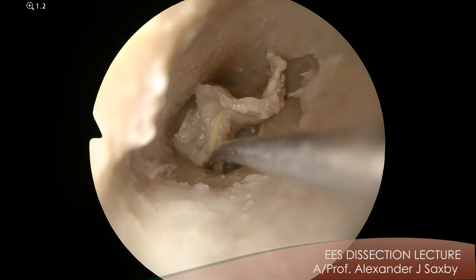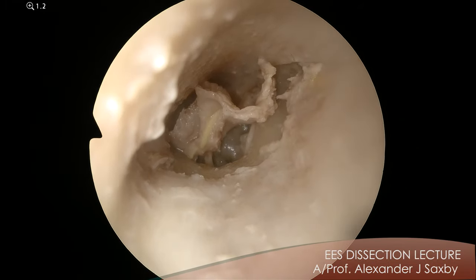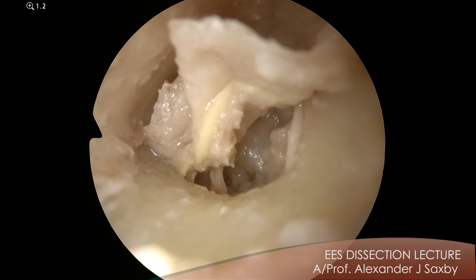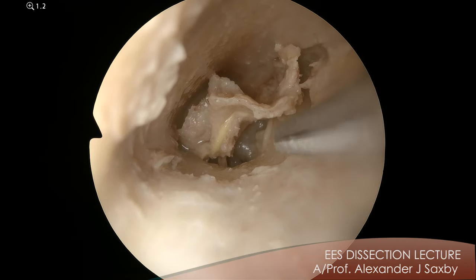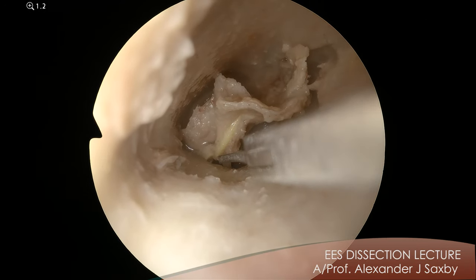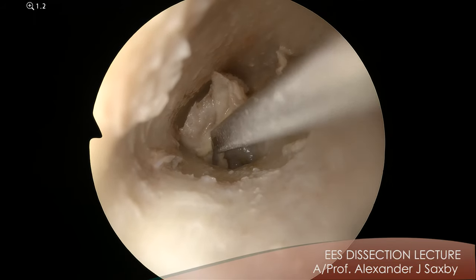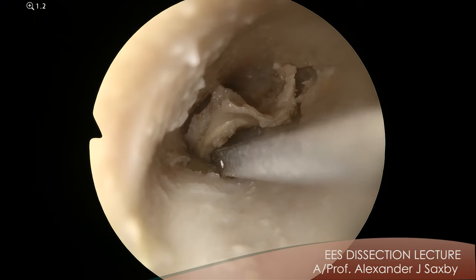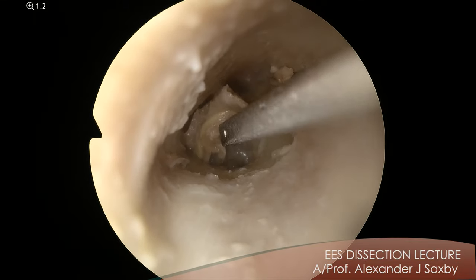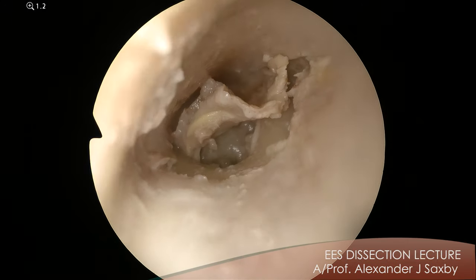It's very thick — can I have some scissors? Bellucci scissors. Can you see that's being held there by that little mucosal strand? You notice that each step needs to be methodical. You need to be a perfectionist. Don't rush your endoscopic surgery like a stapes. Take your time. And by taking your time you're actually faster. It's a weird situation.